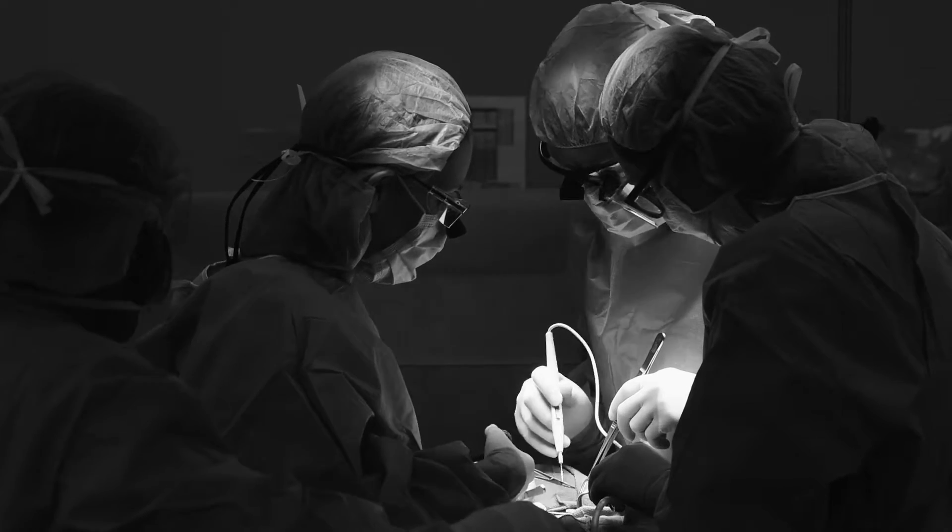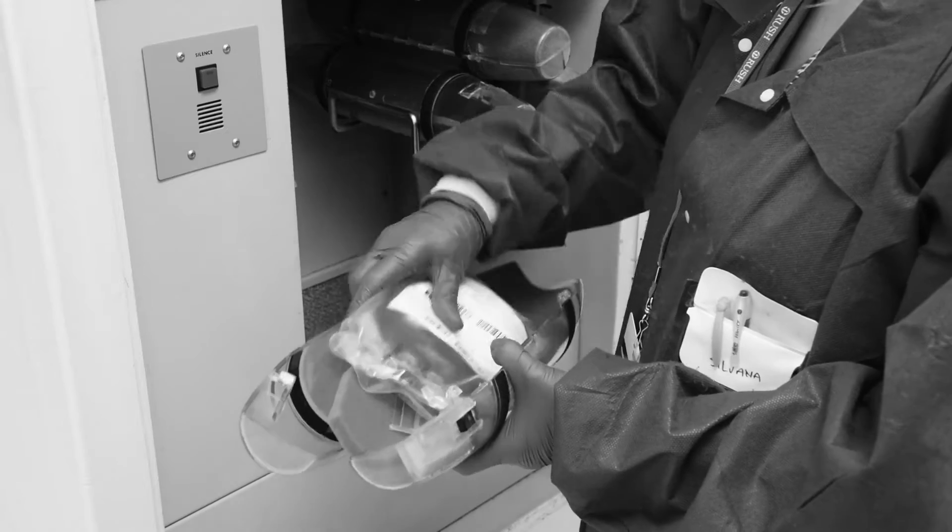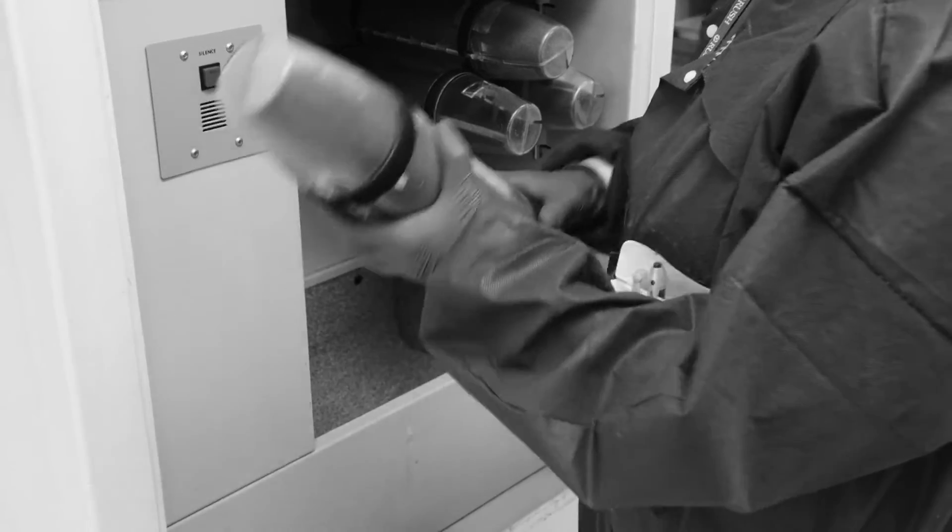Without the blood bank, none of the surgeries can take place. We are very crucial for the outpatient, the Department of Hematology and Oncology.